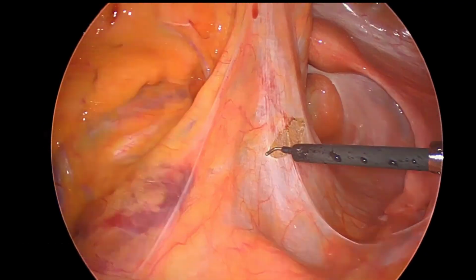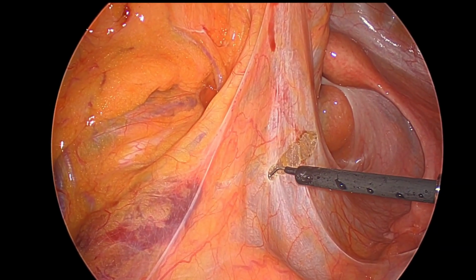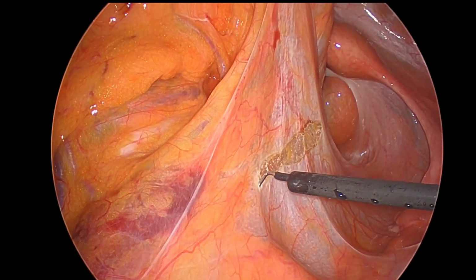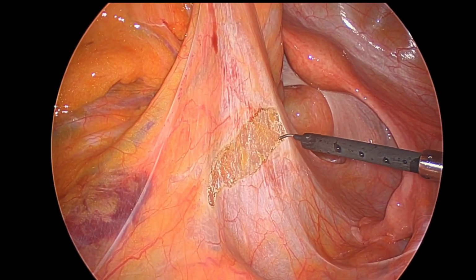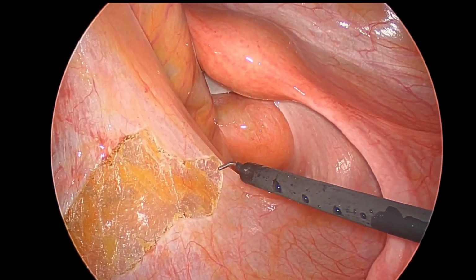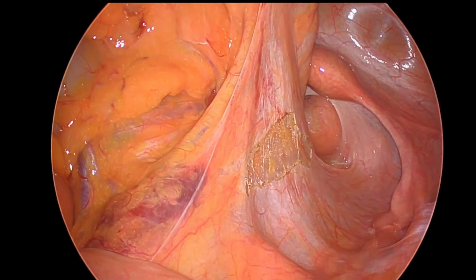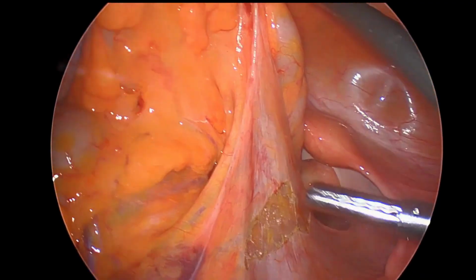So you're going to see all those steps here in a moment. So this is an example dissection. Here we're scoring underneath the IMA pedicle. Again, we start fairly low. We've delivered the sigmoid colon out of the pelvis, and we're scoring this peritoneum on the medial side. Our assistant is grabbing the sigmoid colon to keep the floppiness away.